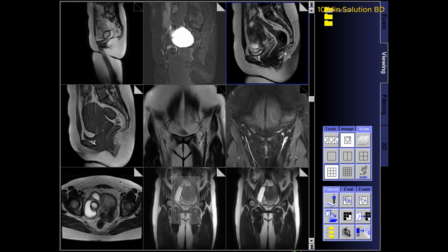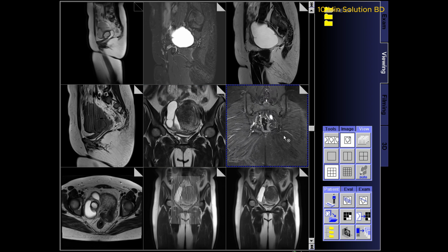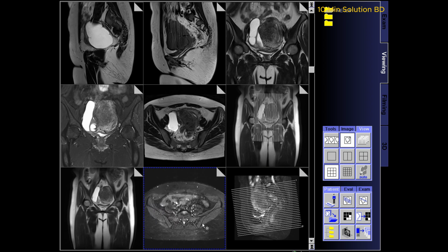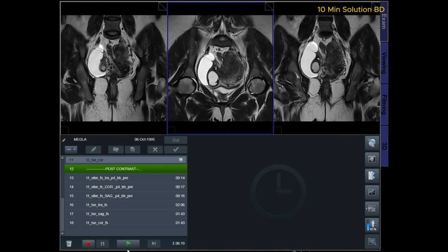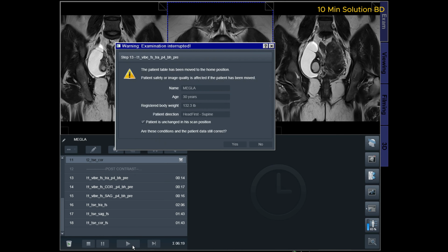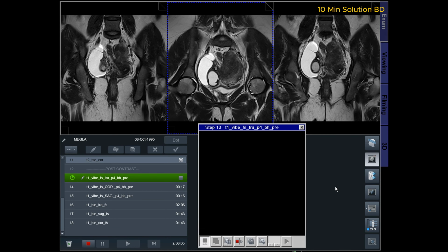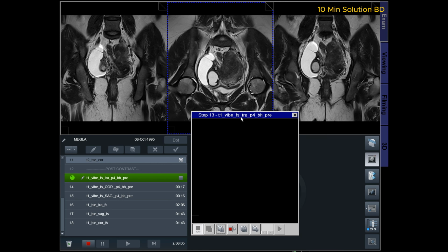Patient preparation for endometrial MRI scans. A satisfactory written consent form must be taken from the patient before entering the scanner room. Ask the patient to remove all metal objects, including keys, coins, wallet, cards with magnetic strips, jewelry, ear aid, and hairpins. Ask the patient to undress and change into a hospital gown.